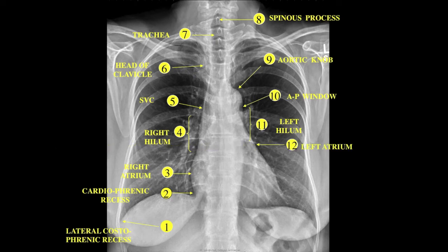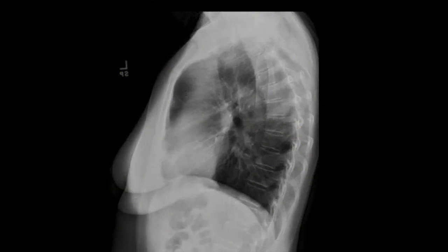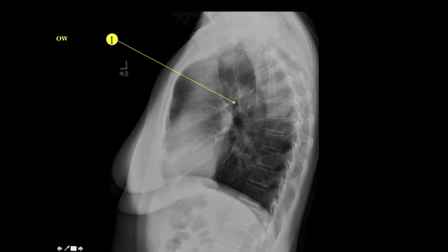The left atrial border, the left ventricular border, the descending aorta — a very important landmark on the PA radiograph — lets us evaluate for any disease process involving the left lung base. The gastric bubble is also visible. The lateral view is slightly more challenging, and we will revisit again the anatomical structures on the lateral radiograph.